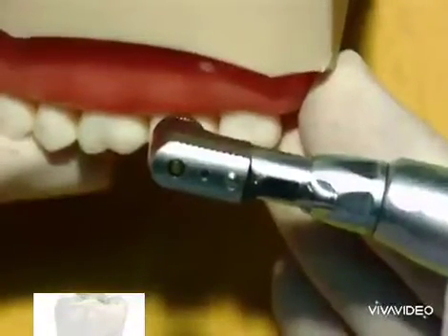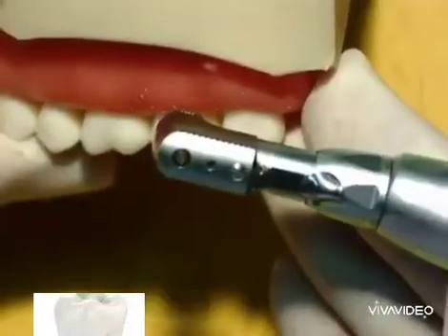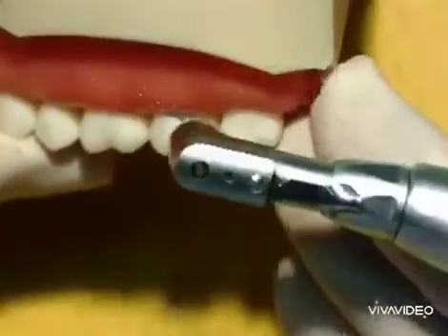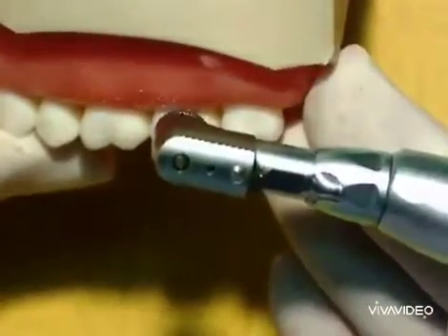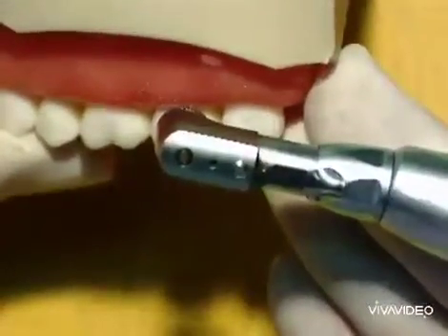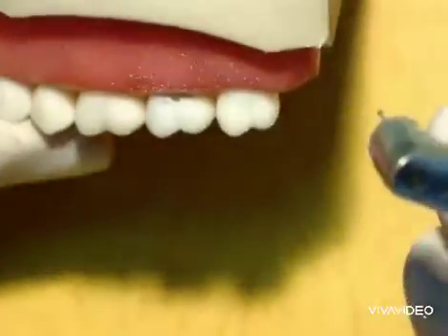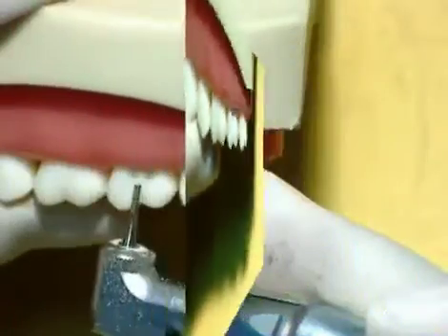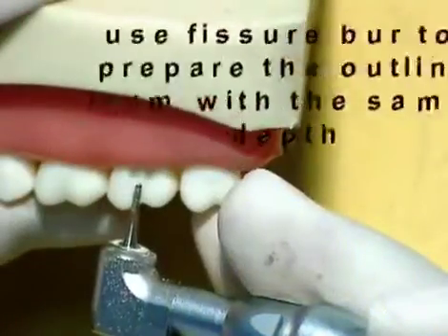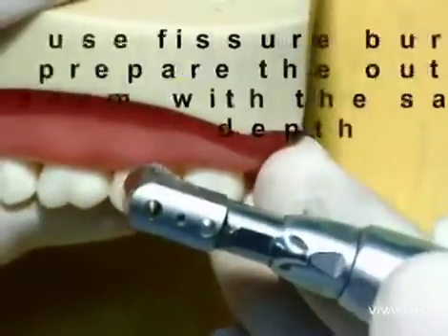Using a small round bur to do penetration in order to determine the depth of the cavity, which is 1.25 mm. Penetration is done.